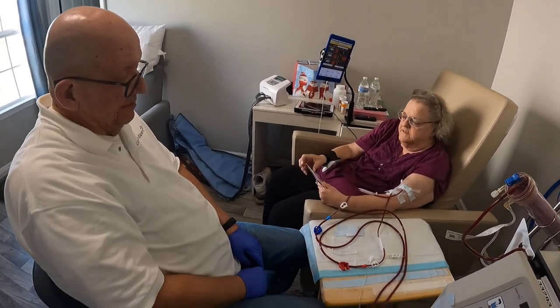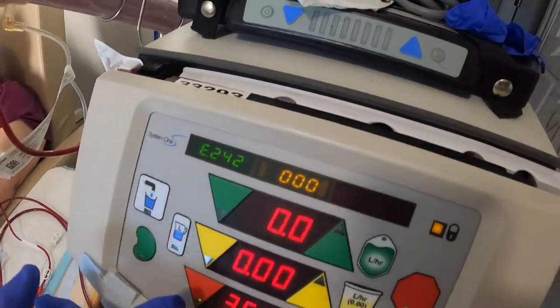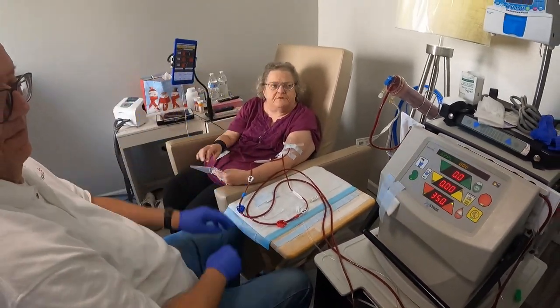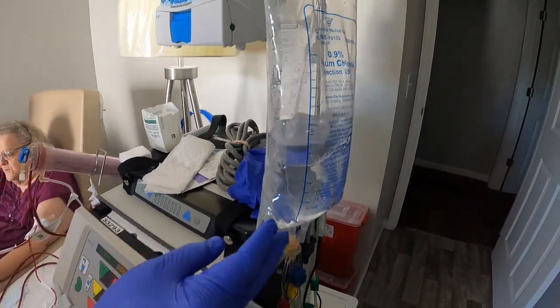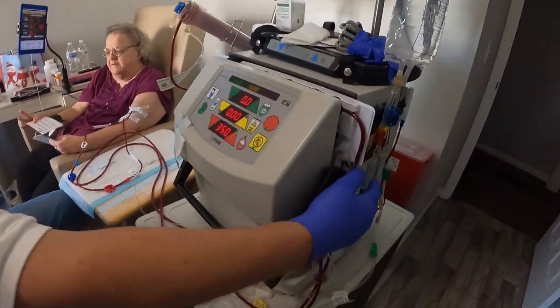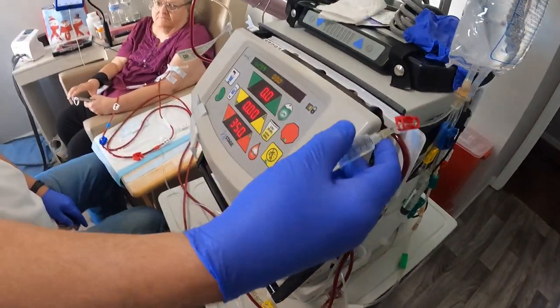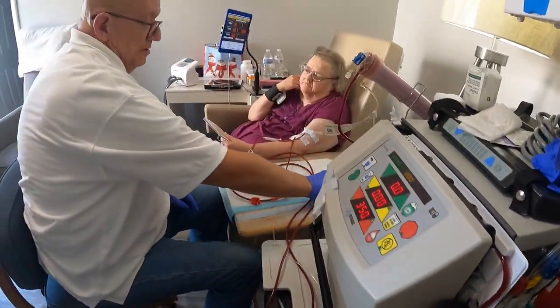When treatment has ended, you will see three sets of zero and a 350. Sanitize hands. Make sure there's still 300 ml of saline in the bag. Remove the tape clamp, fold in the lines, which we did. Fill the syringe under the red clamp on the saline bag. We do this in advance. I do it when I hook it up instead of doing it now.